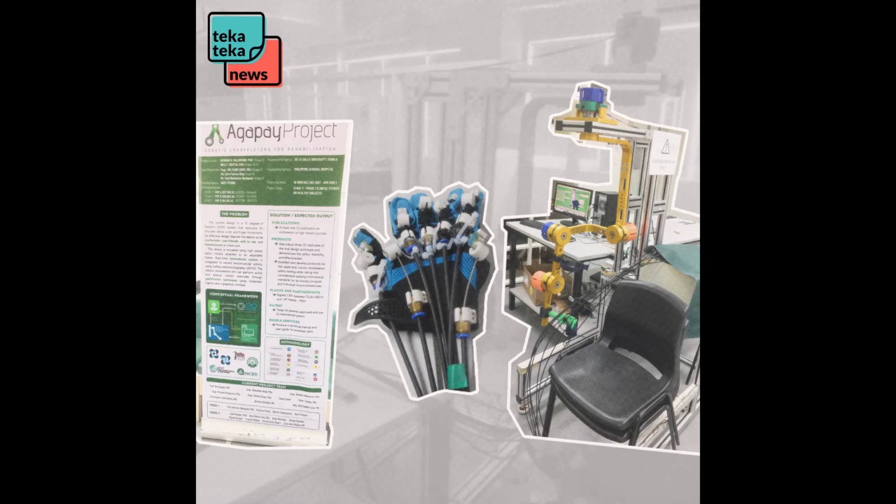And another challenge yan naman, nung tapos na yung fabrication, but we need to test. Some of the testing facilities don't exist here in the Philippines. You have to test and evaluate it in terms of medical standard niya. Safety siya na item. This is something that if we play our cards right, we find the correct value engineering firm, we can reduce the weight. Kasi at this point, medyo mabigat siya eh. Yeah. But it fits already on a backpack. Yung yung kanyang control mechanism.